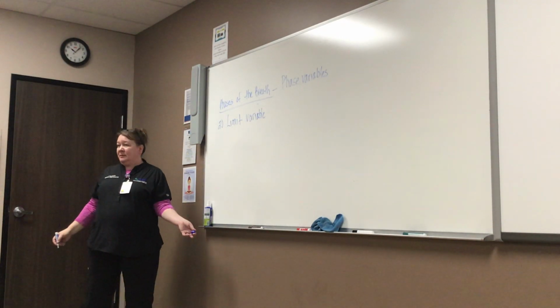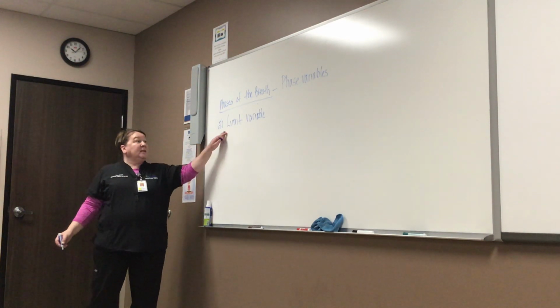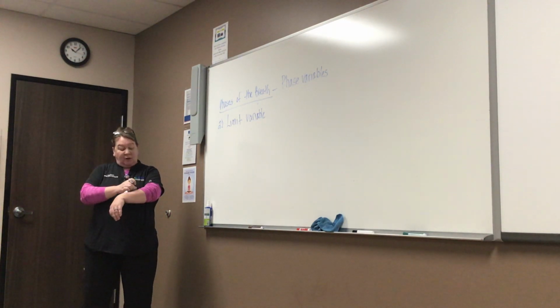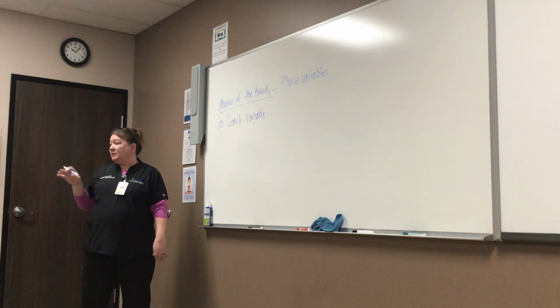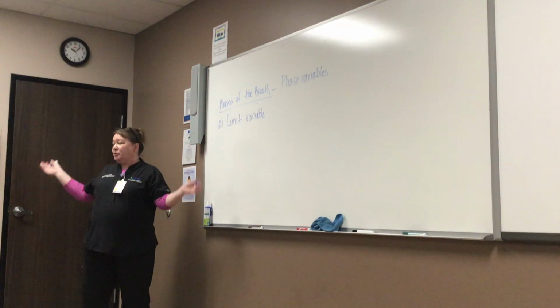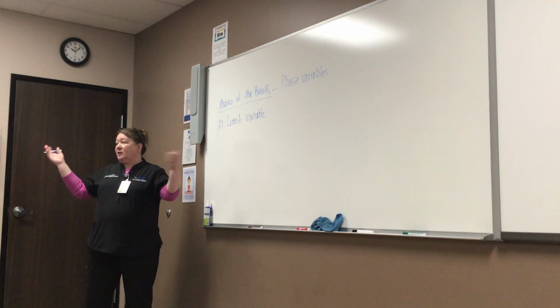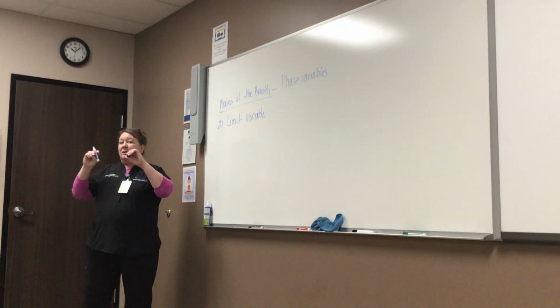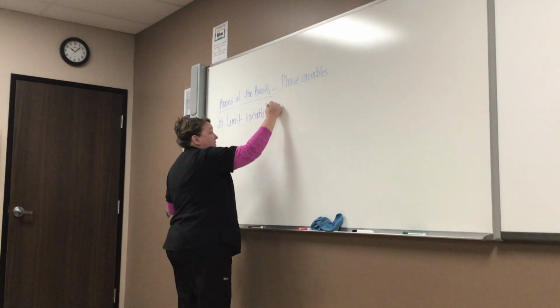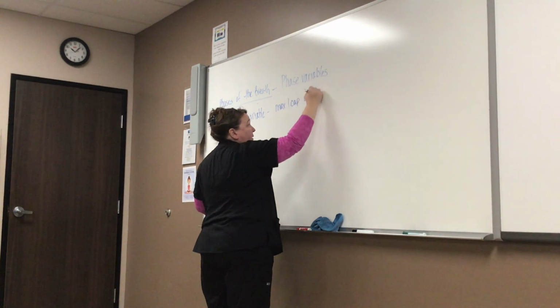So trigger, we started the breath. The limit variable is going to kind of put a cap, a max, on the breath. So you're saying don't go above a certain volume or don't go above a certain pressure. Because if you didn't, it could go as high as it wanted. So we have to say, we need the parameters on it. Does that make sense?